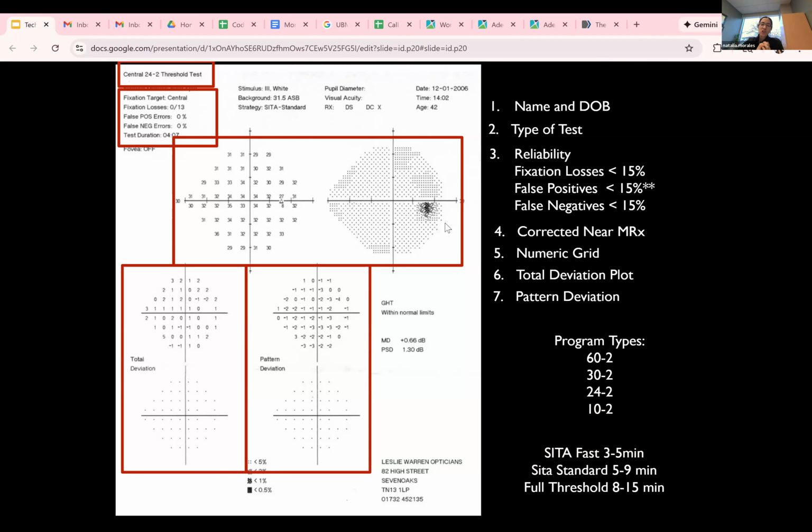And so it can be helpful in patients who have more end-stage glaucoma to follow a 10-2, or alternate it with a 24-2, to find those subtle changes with time. A 30-2 is a good test for screening, for example, when you're testing more broadly, like, is anything generally missing? Here's a bigger visual field that we're testing. I would say you're probably most used to seeing 24-2s. And like I said, that little notch pointing at the nose is how I typically will quickly know it's a 24-2, but you can always look at the top too.